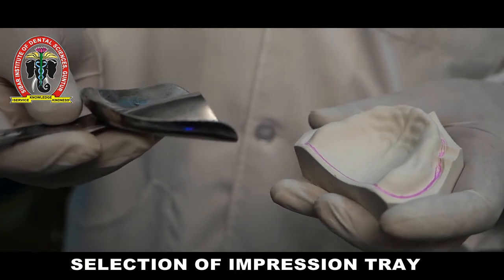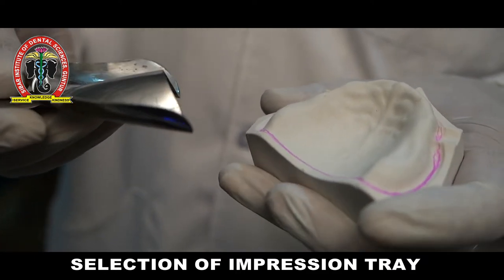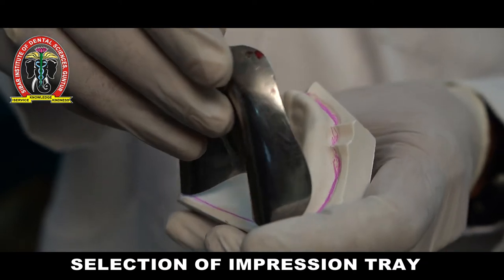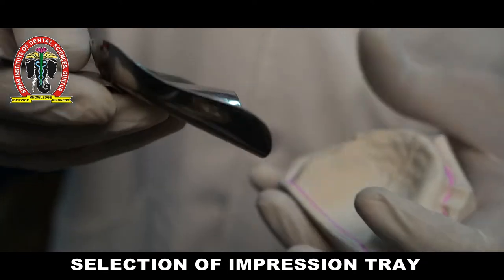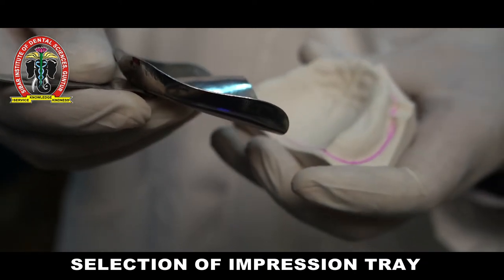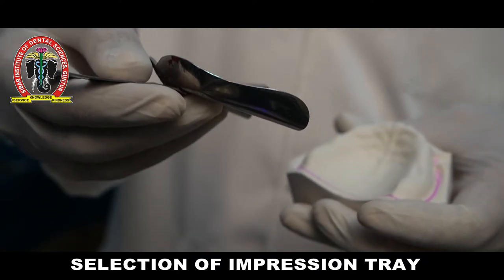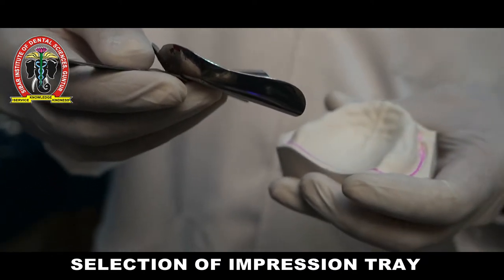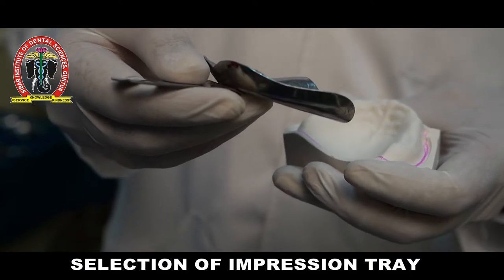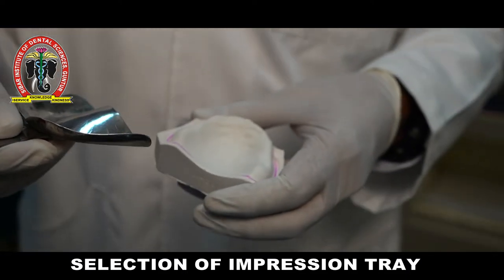The tray selection is demonstrated on the edentulous model. The tray should cover all the required anatomical areas and there should be adequate space for the impression material. Then check it in the patient's mouth to confirm it is covering all the areas required for the impression procedure, and then select the tray.